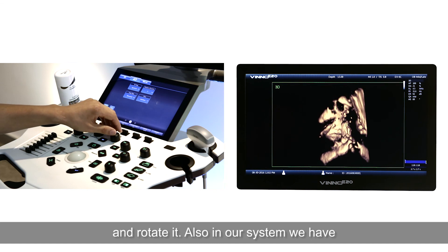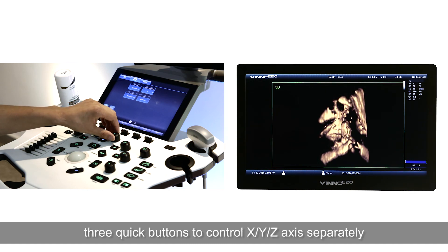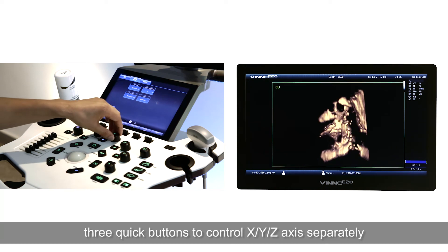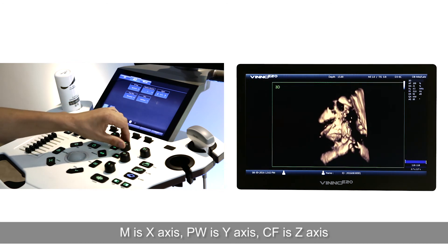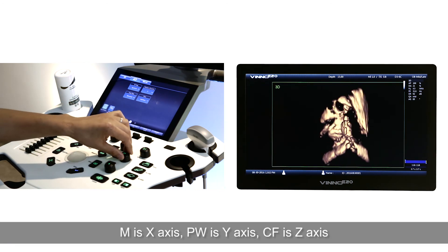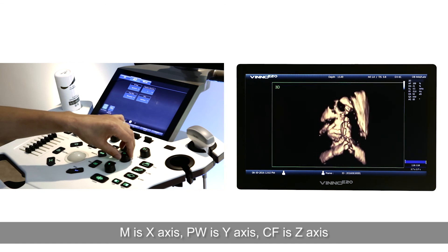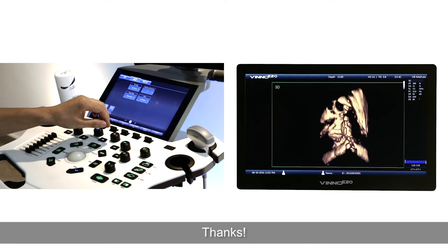Also in our system, we have three quick buttons to control the X, Y, or Z axis separately. M is the X axis, PW is the Y axis, and CF is the Z axis. Thanks.